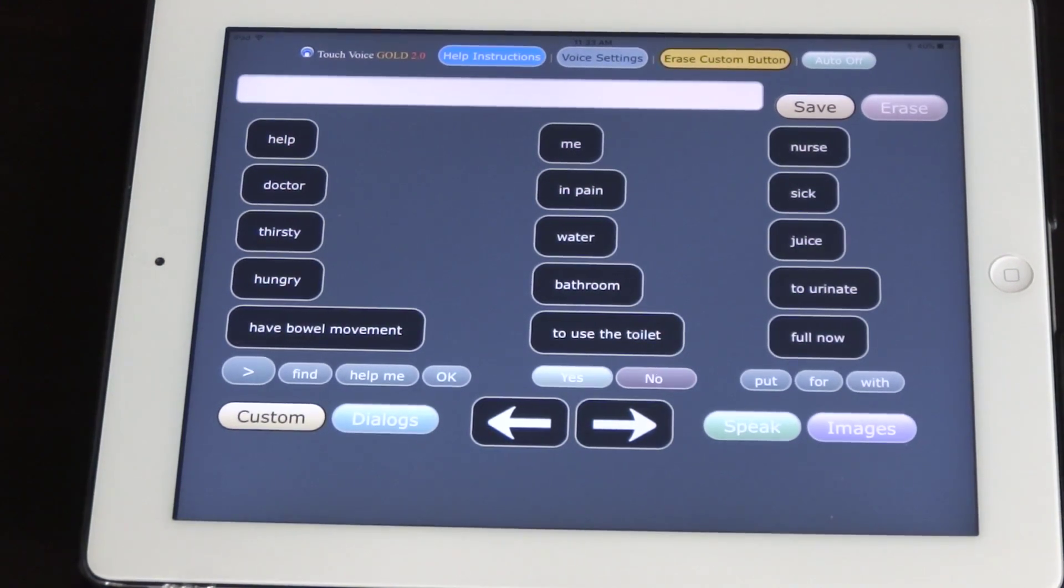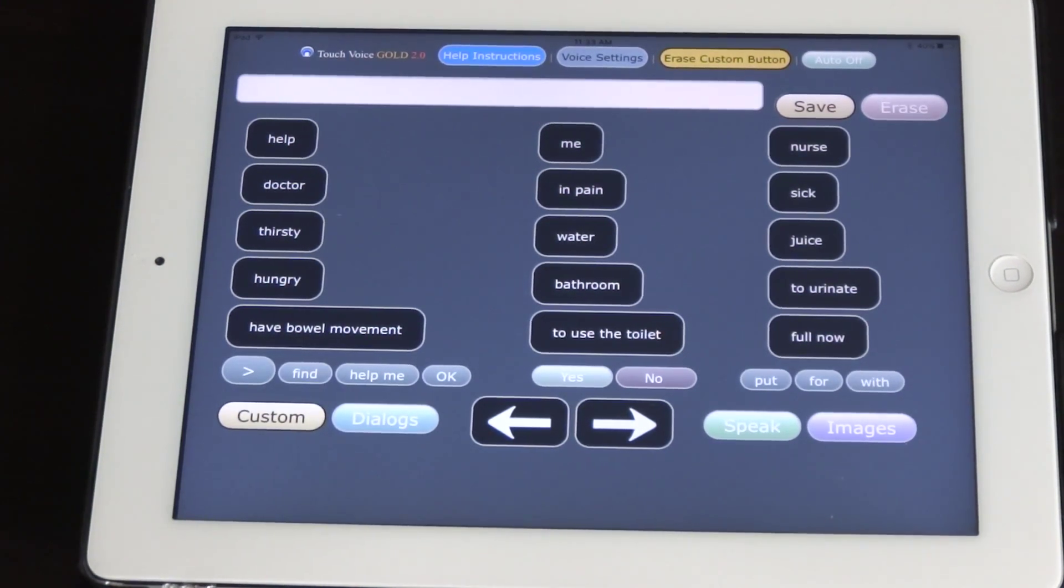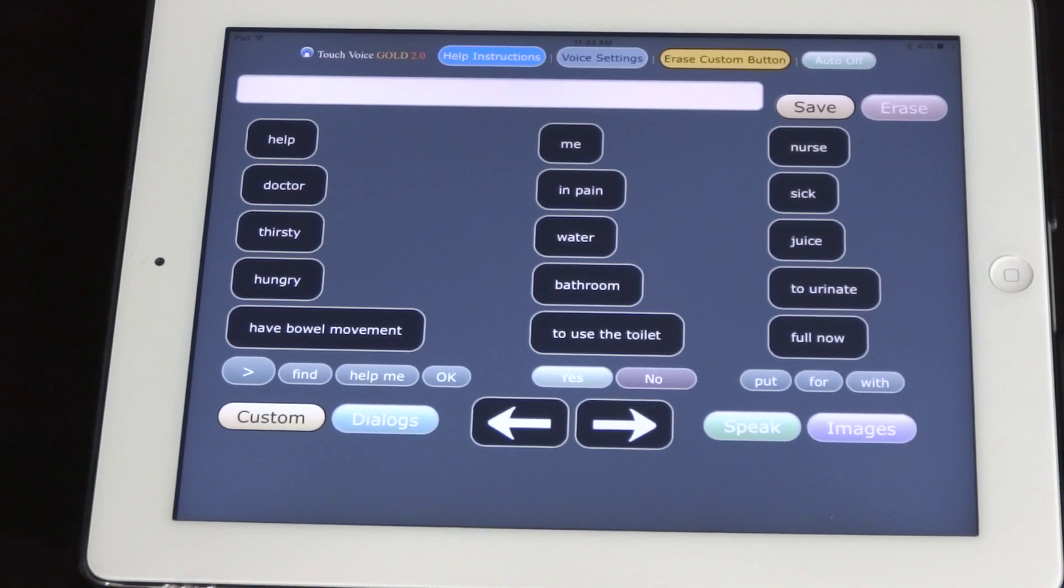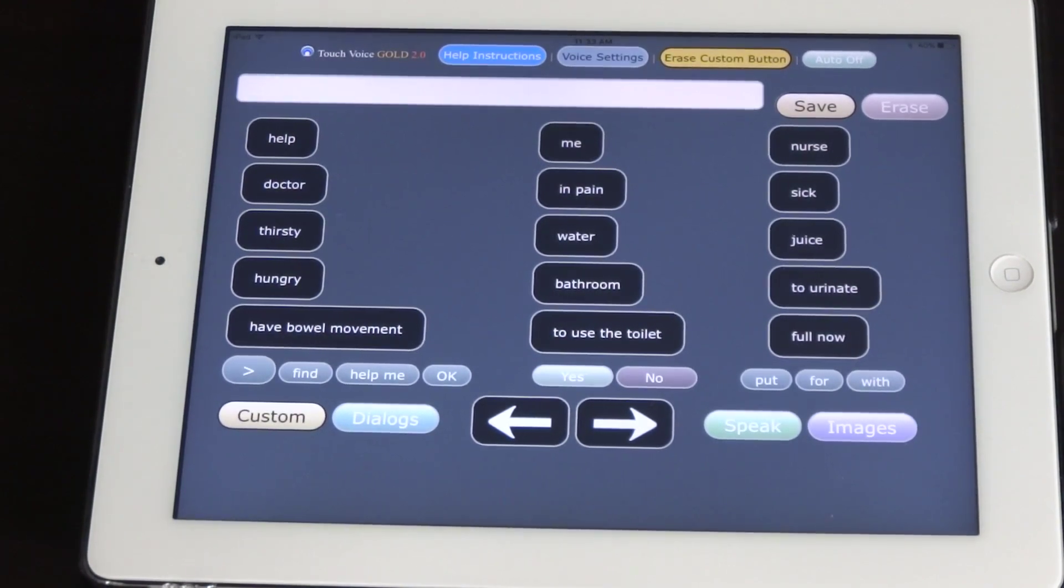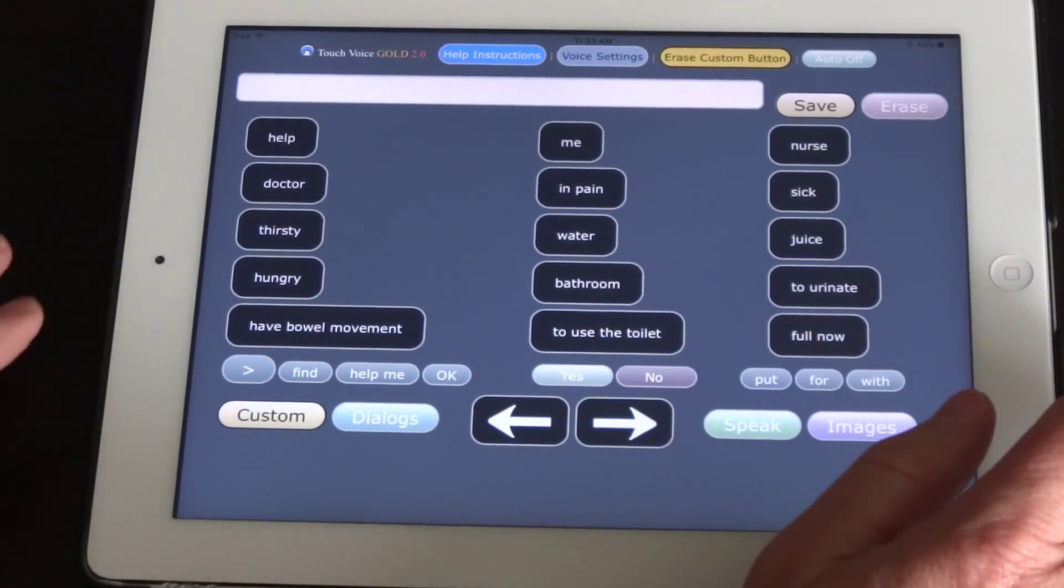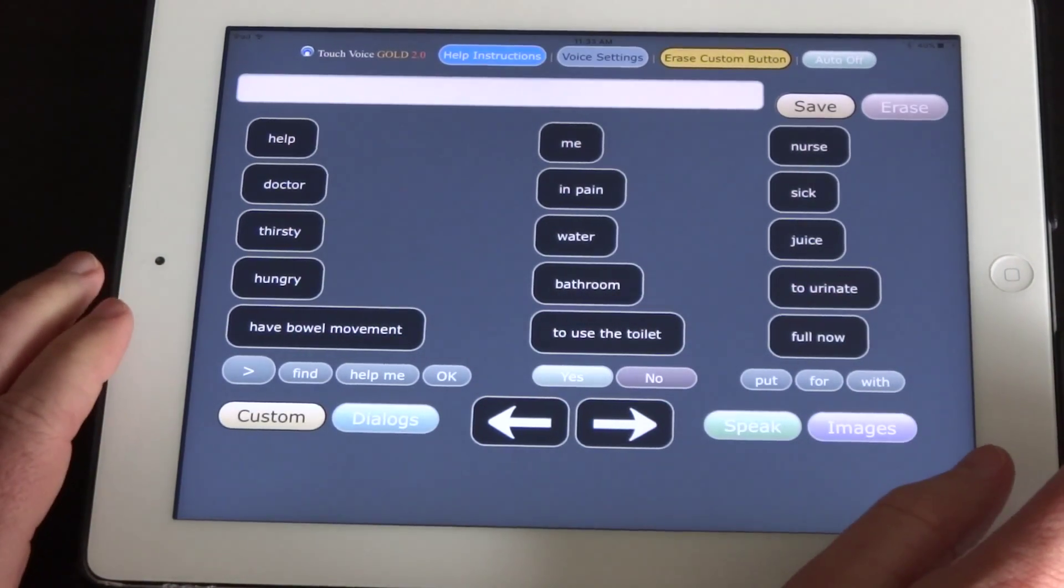Hi, I'm going to do a very quick instructional video on how to use Touch Voice Gold for the iPad. This is the main screen.